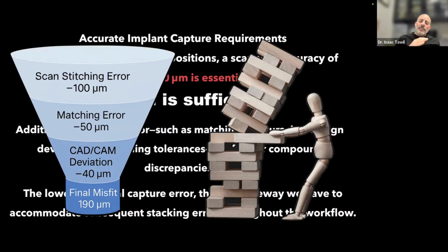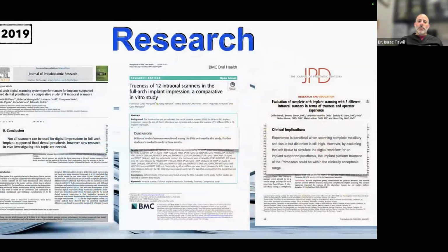So we need to have as little discrepancy at the time of capture so that we can have the best amount of success and leave more room for other things that may have errors, such as milling errors that may occur. So it's more important to me to start off with a very positive, successful capture, and then later on, if there's any issues, I'll be able to catch up with it.